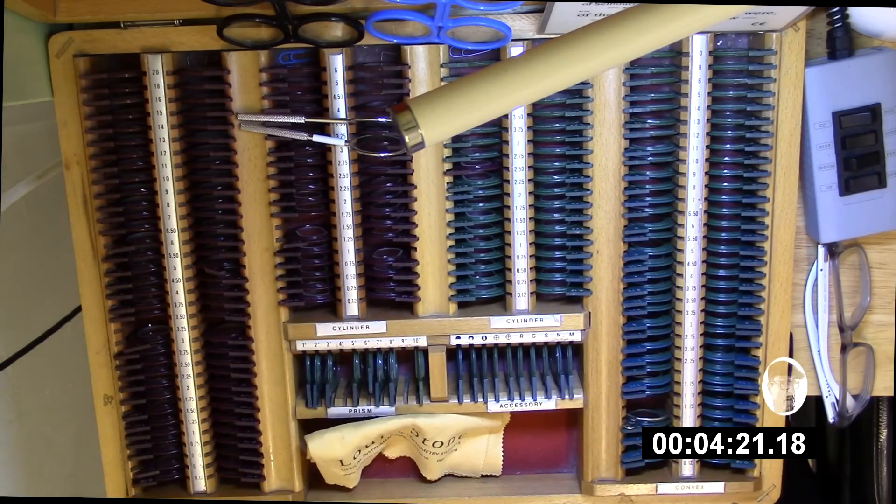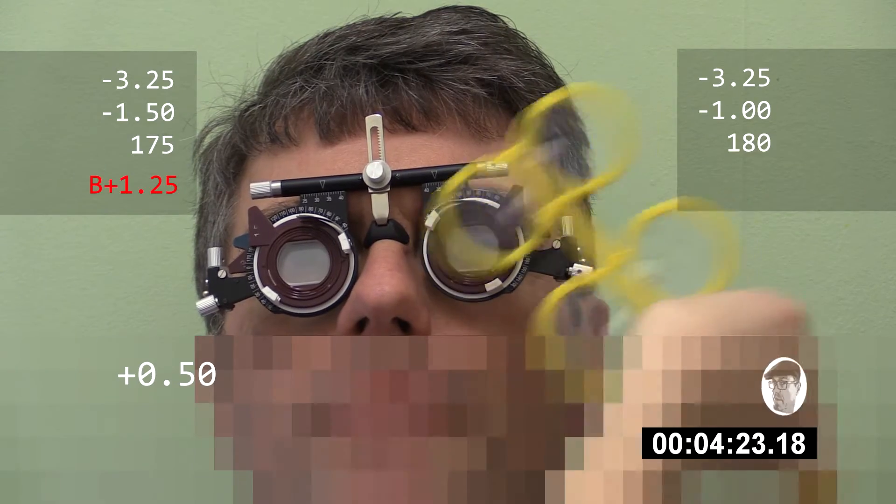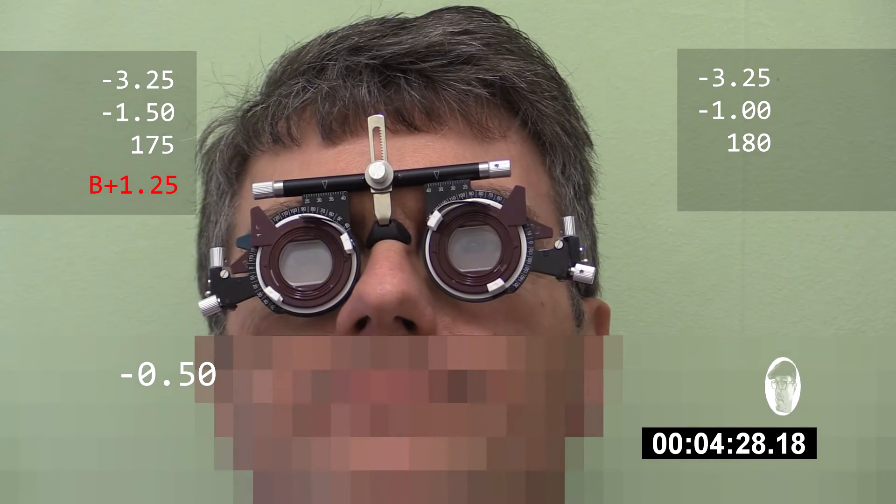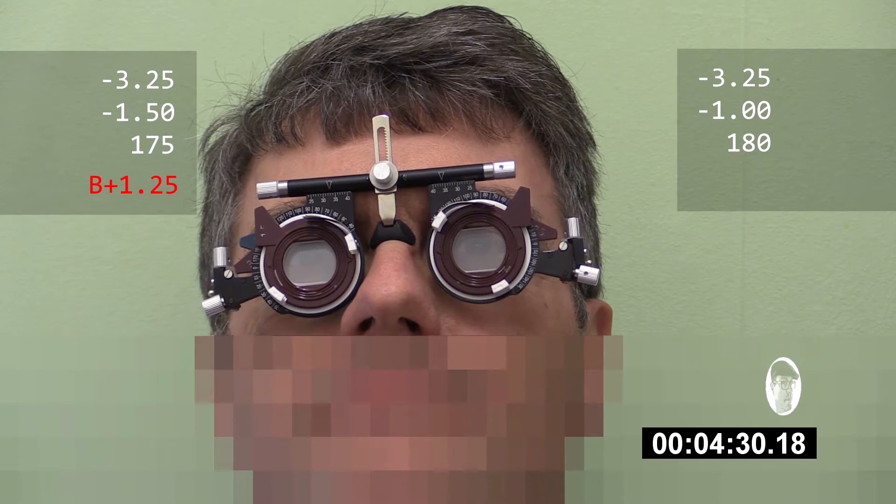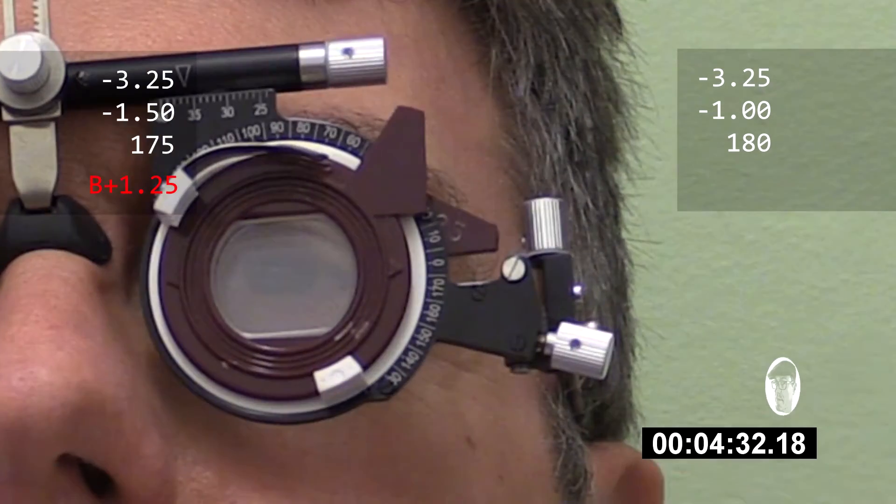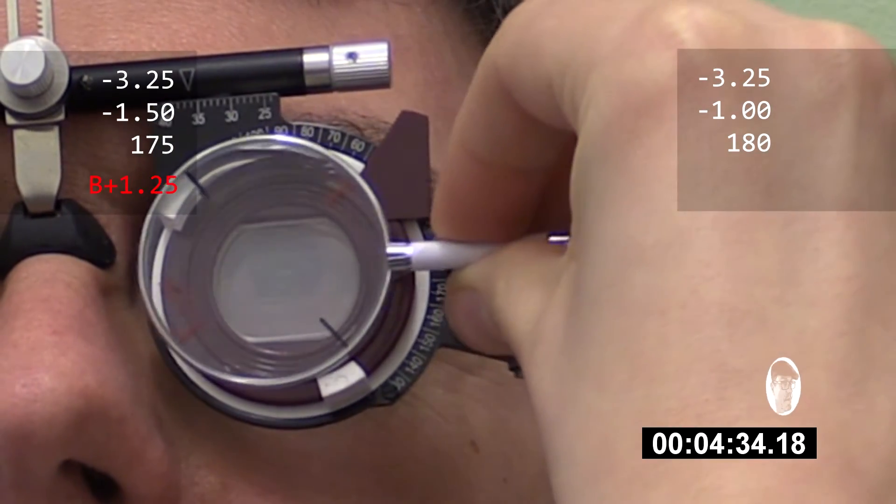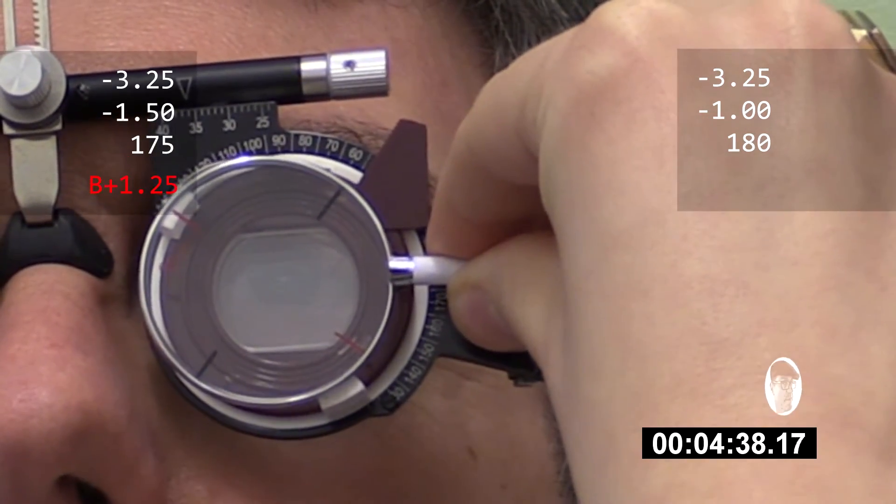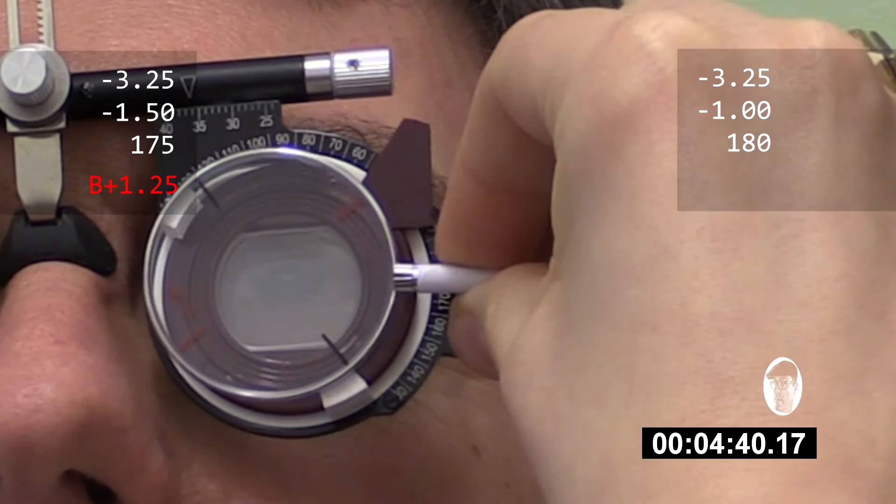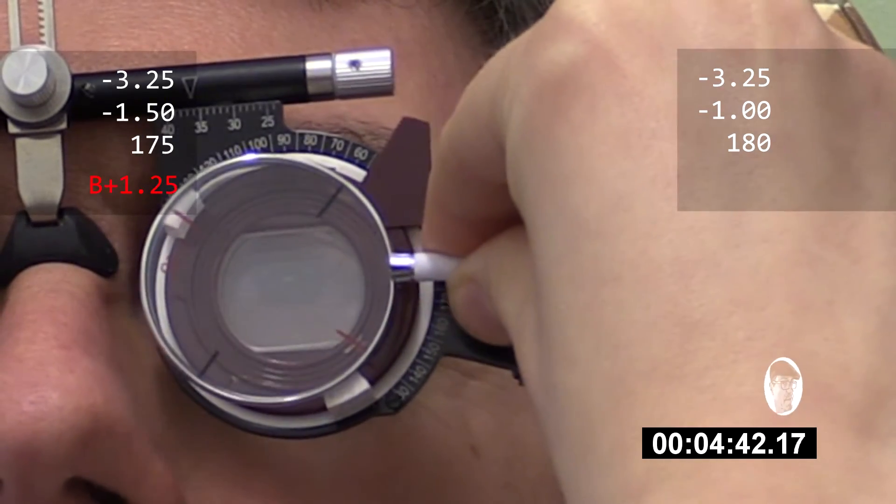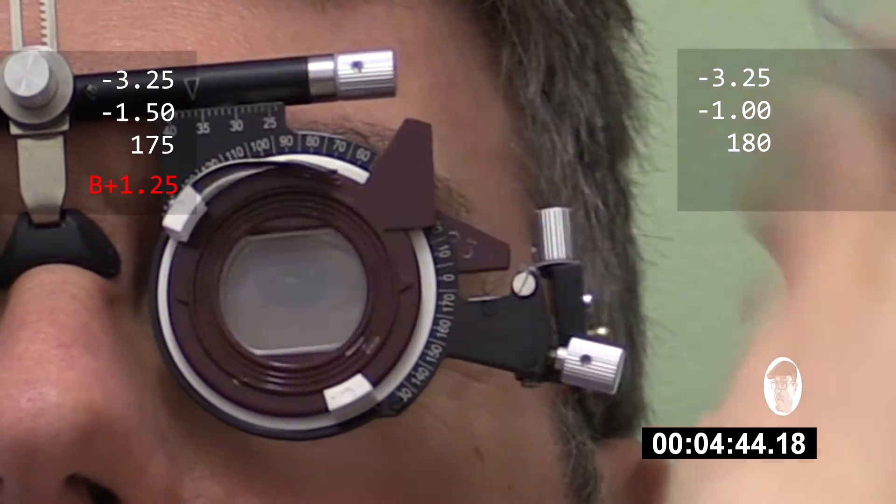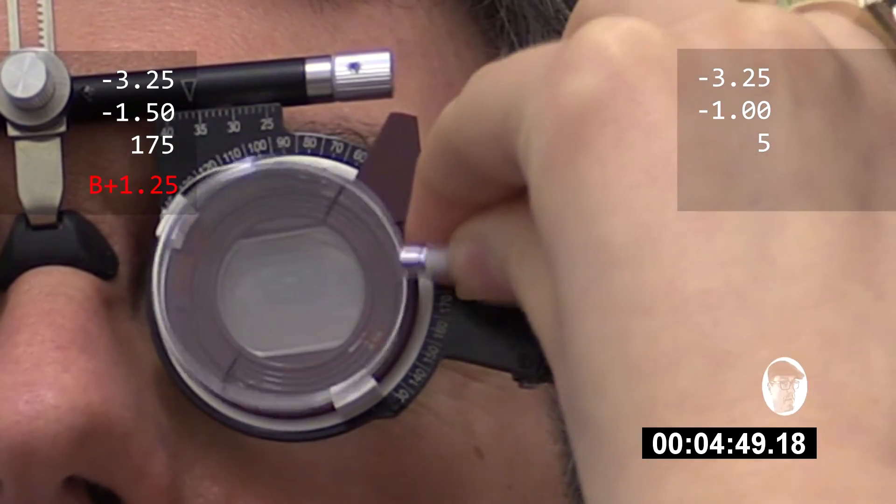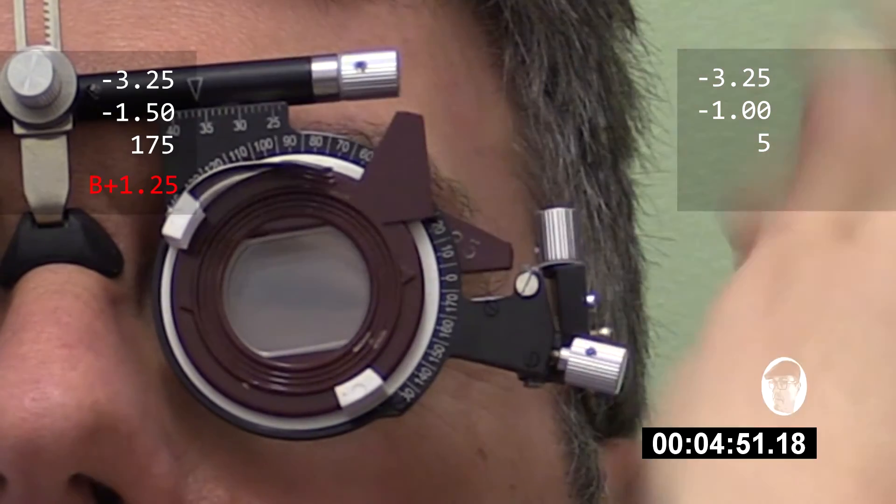Okay. And clear with, without. Okay. And with or without. No real difference there. Looking at the white background and the circles on it, are those circles rounder and clearer with one or two or about the same? Not sure. Show me again. So that's one, and that's two. Maybe one, not much. Maybe one.